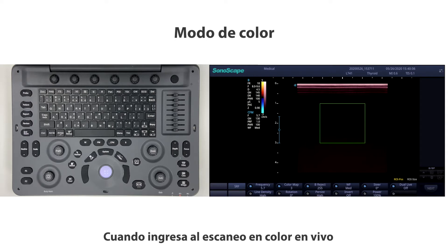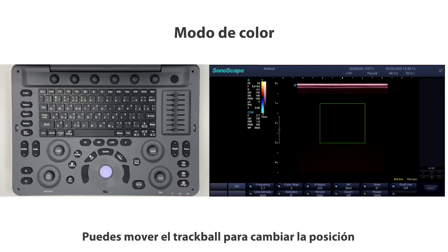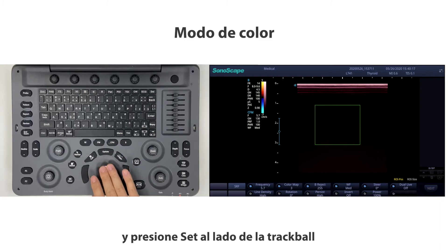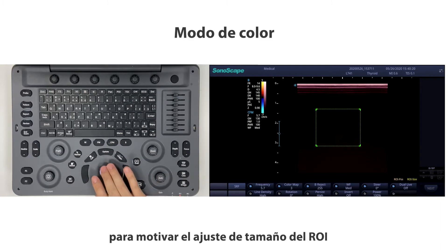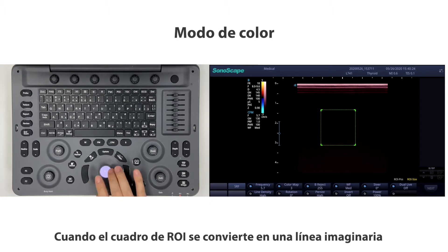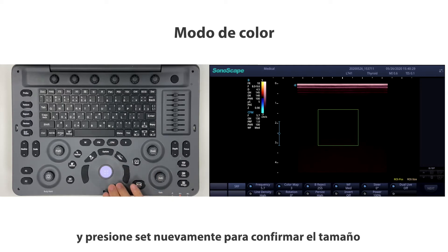When you enter live color scanning, the ROI box will appear in the center of the image area. Move the trackball to change its position, and press SET beside the trackball to activate size adjustment of the ROI. When the ROI box turns to a dashed line, move the trackball to adjust the size and press SET again to confirm.